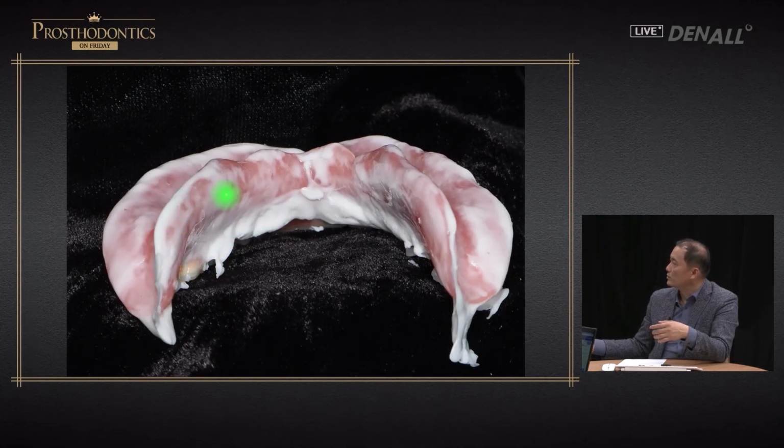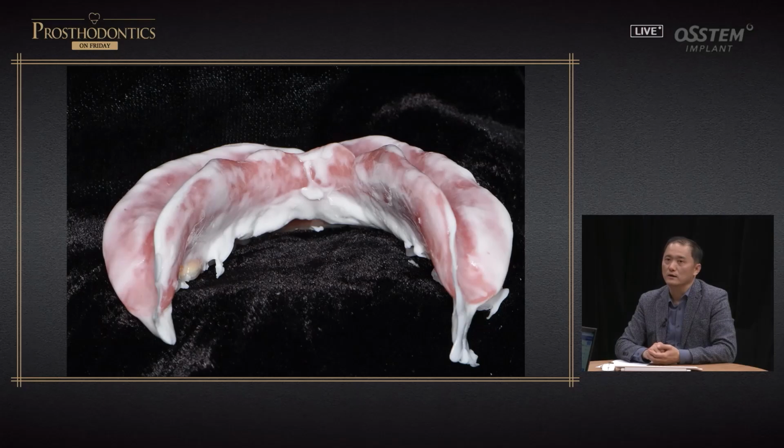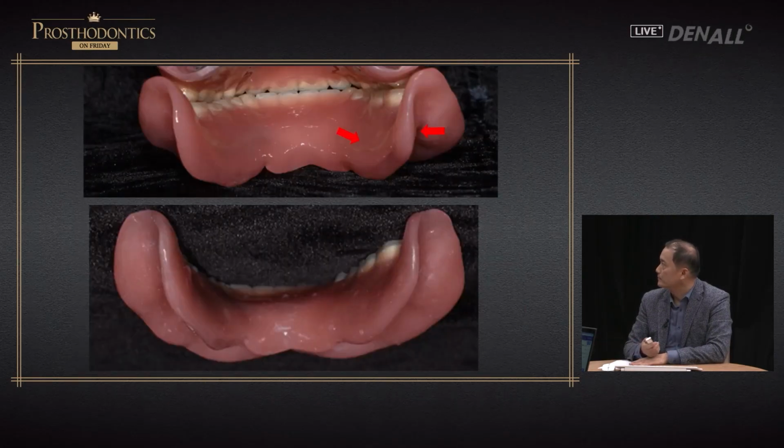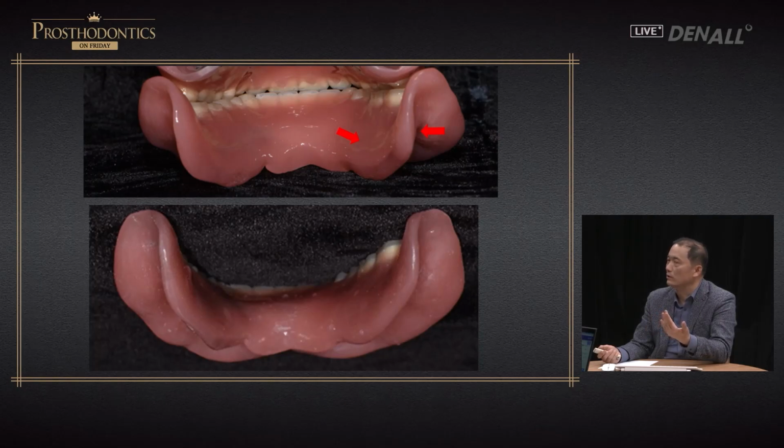So eliminate the areas that come into excessive contact, and then the areas become thinner and better. So this, as you see, overall, is similar in thickness. Hence, in fit checker, the tissue adequacy and the border length is what you look at, but even the surface area should also be looked at and photographed, and through that you can gain more information. And on the cheek and other areas, you can check whether it was done adequately, and whether it's seating well with the surrounding tissues. And this is after making it. It was really thick, and there was a clear line with the thick area, but it has become concave, molded, and thinner, and will sit well. So it's much better in terms of stability, or there's no change.